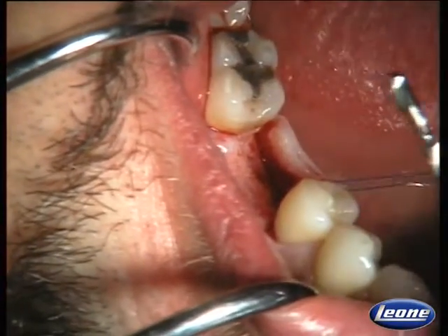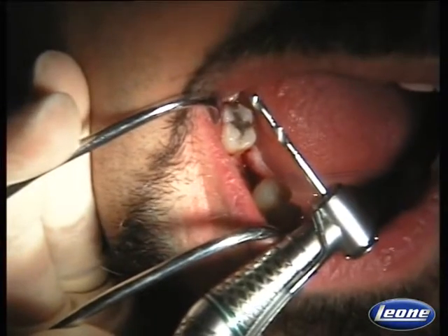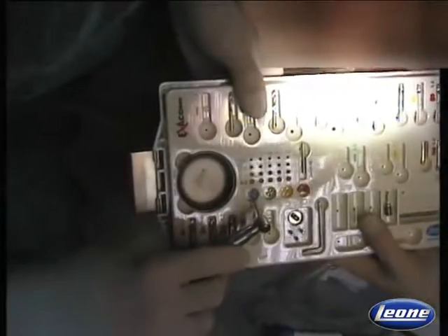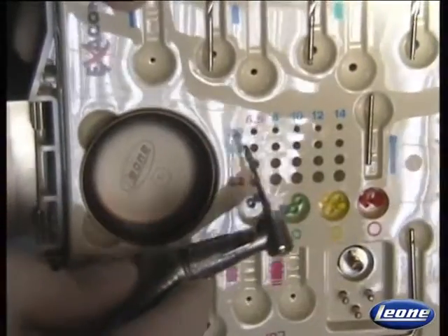This is the pilot drill of the Leone implant system. It has depth marks of 6.5, 8, 10, 12, and 14 millimeters. To improve the visibility of the drilling depth, we can use color-coded depth indicators. I place a blue ringlet on the pilot drill.